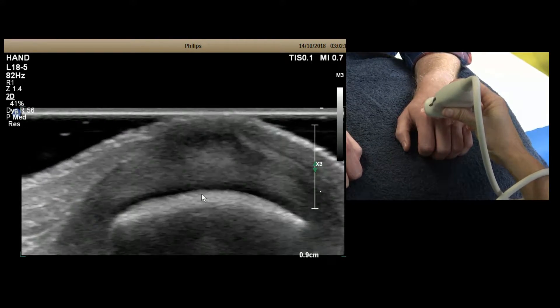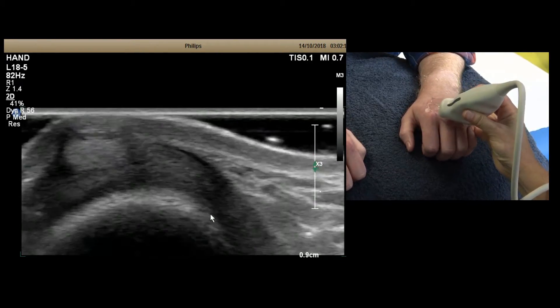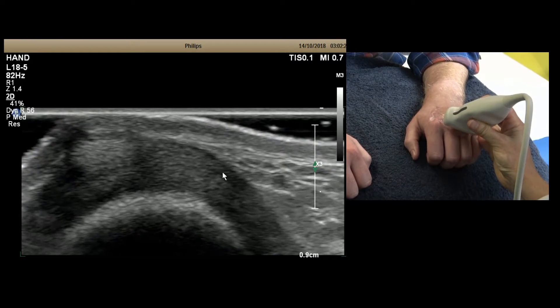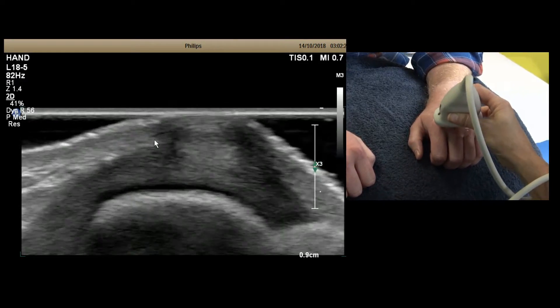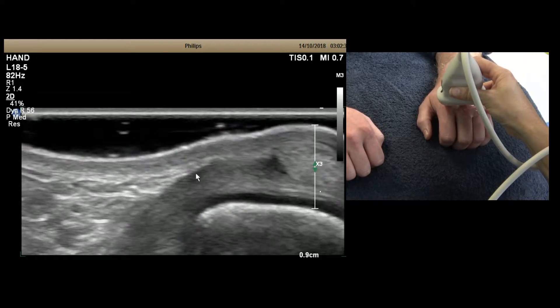The sagittal band keeps the tendon centrally placed. If you rock onto one side of the camera you'll sometimes get a better view of the band coming off the side, as it wraps down the sides of the joint. Rocking onto the other side lets you assess that part of the sagittal band as well.